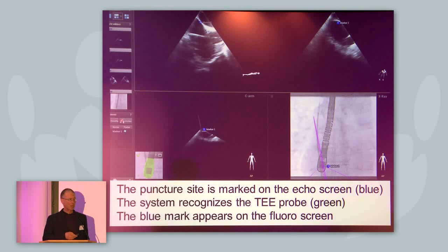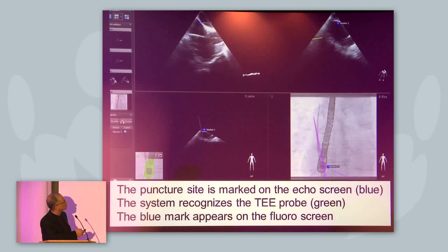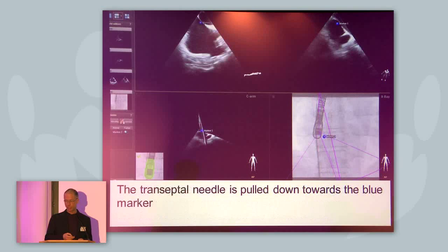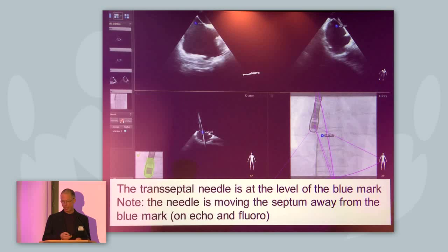This shows you an example of transseptal puncture. Marks are made on the echo screen where you want to puncture the interatrial septum, and this mark then appears on the fluoro screen and guides you during the procedure. At this point the transseptal needle is pulled down towards the blue marker, and then the transseptal needle is at the level of the blue mark.